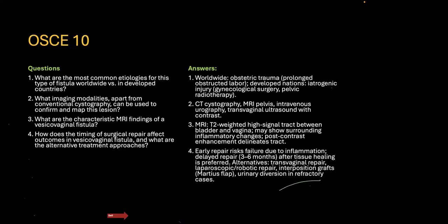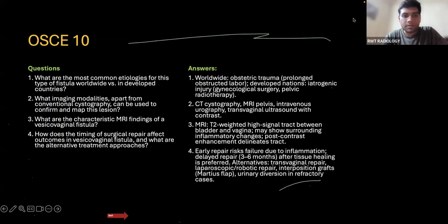So I hope you got a brief idea of how to approach the cases, OSCE cases, as well as the spotters. And I tried to cover a lot of spectrum, right from the fetal case, imaging cases, breast images, and hysterosalpingography. So, any questions you want? You can write your questions in the chat box.